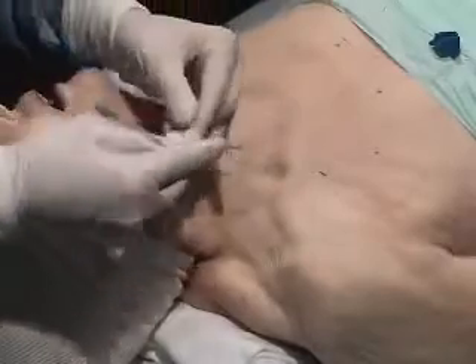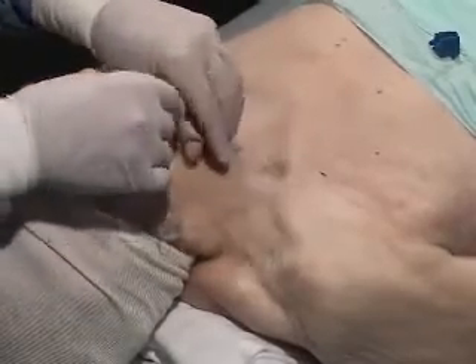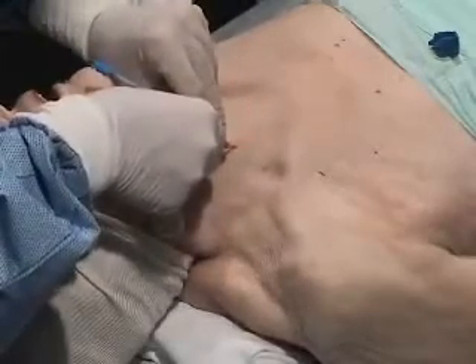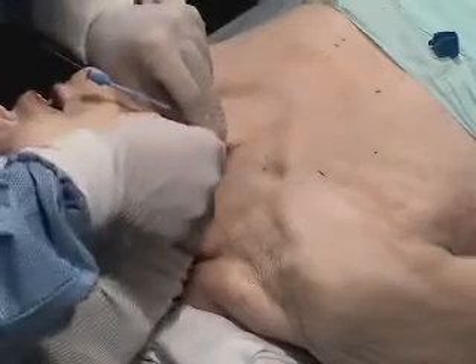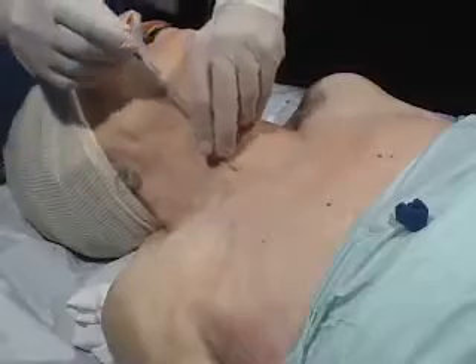The dilator is preloaded onto the wire. A superficial incision along the tract of the wire is made using a number 11 blade. The subcutaneous tissues are dilated.